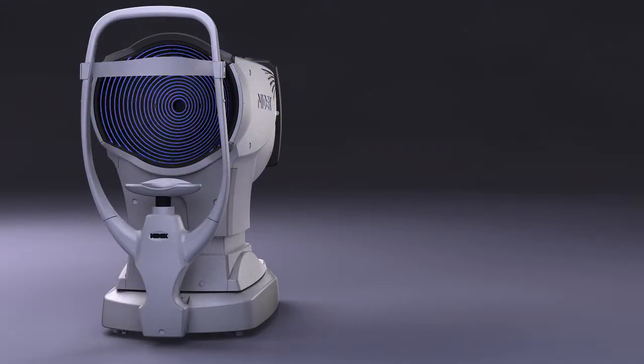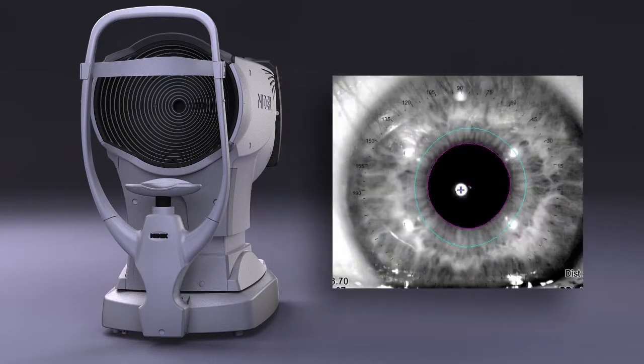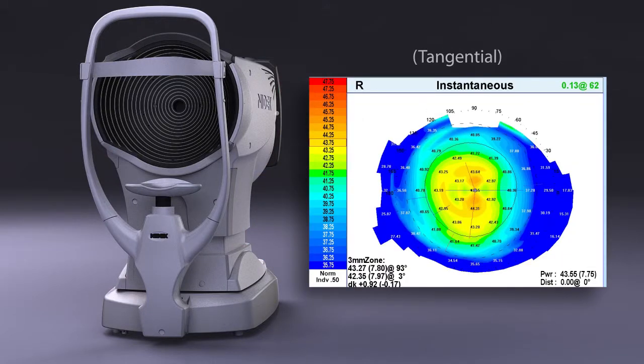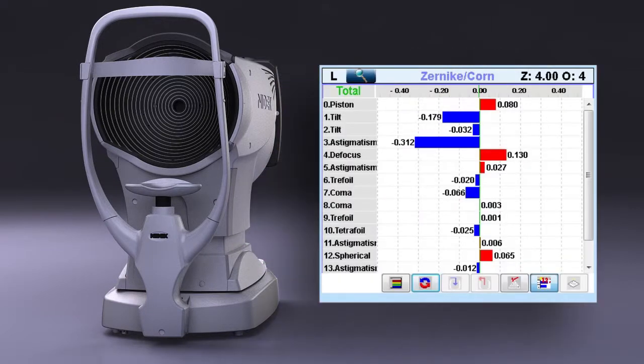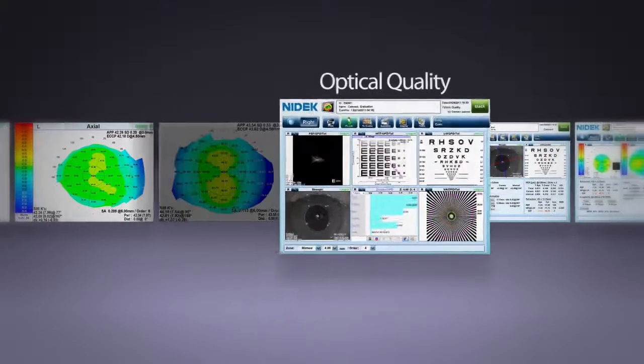The blue light corneal topography provides you with keratometry, photopic pupil, axial, instantaneous, tangential, gradient, Zernike graphs, and elevation maps.